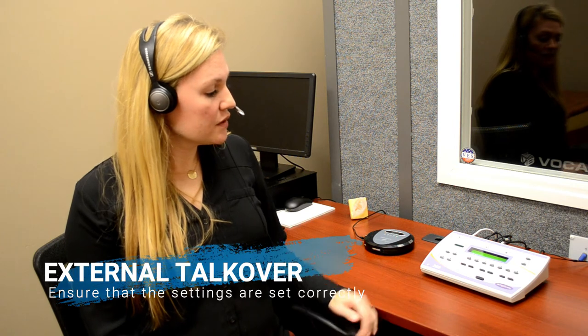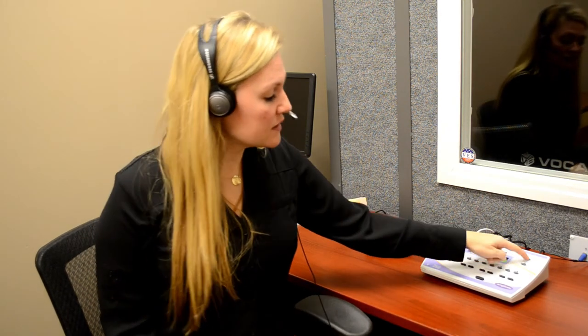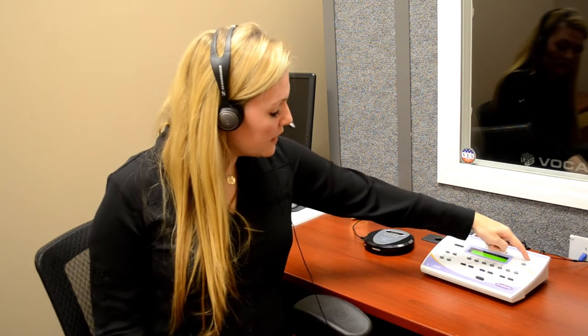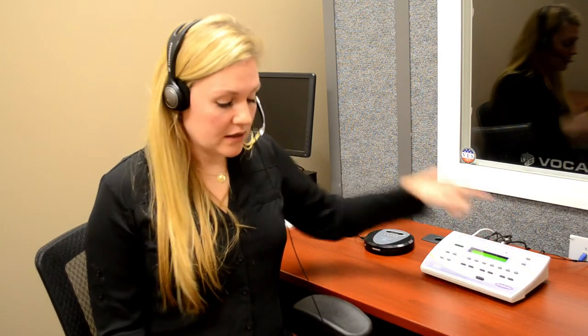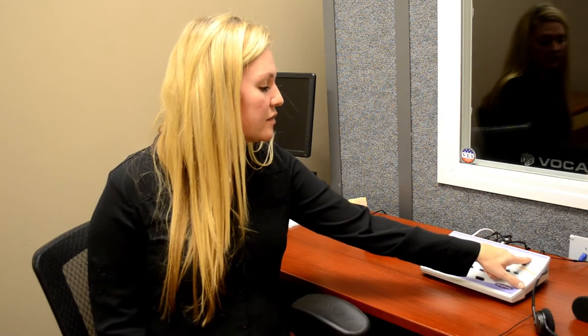So if you are using a sound booth with this device and you are doing speech testing and you have a headphone like this, you can press the talk over and they can hear you through the mic. And then if you don't have a headphone set like this, you can still communicate with your patient because there is a built-in microphone. And so again, you would just press talk over and they should be able to hear you.